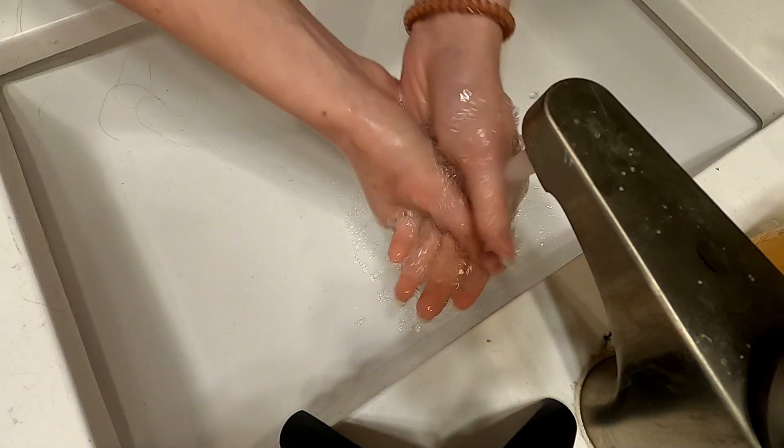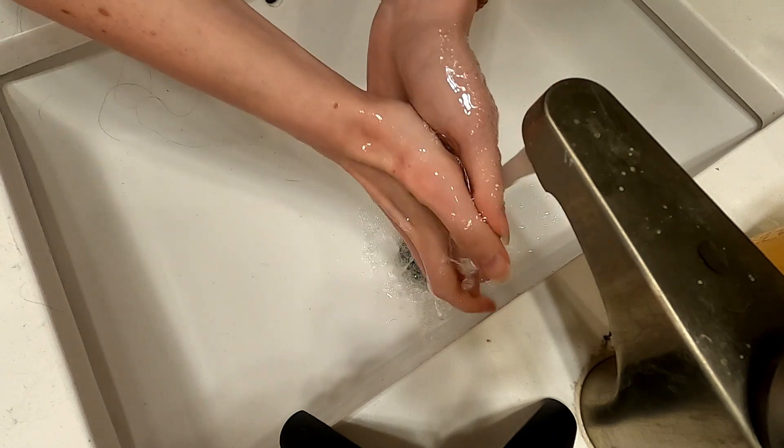The first and most important thing is probably to wash your hands, because you do not want bacteria in your eyeballs. Definitely wash your hands, and when you're putting them in, make sure your hands are dry.